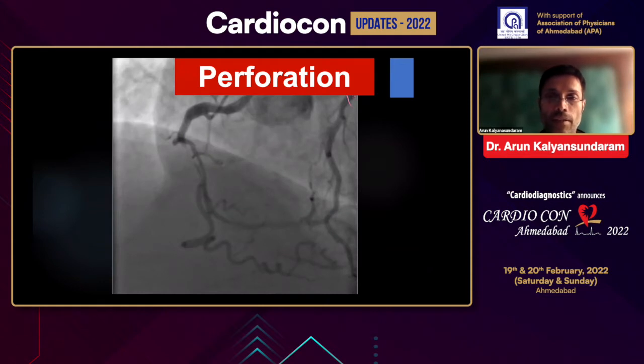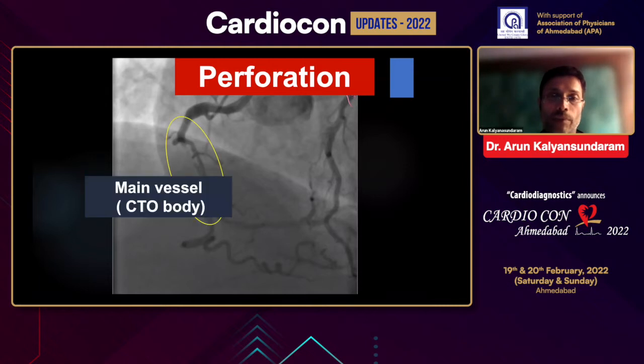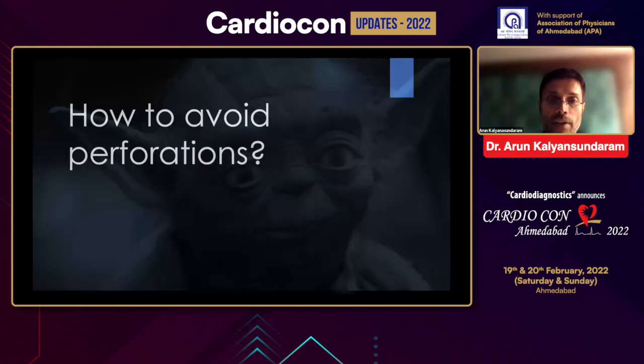Perforation is probably the biggest challenge, and we are always worried. This is a real risk when we are talking about CTOs. This can happen in the main body, the distal vessel, or in a collateral. So how do you avoid perforations?